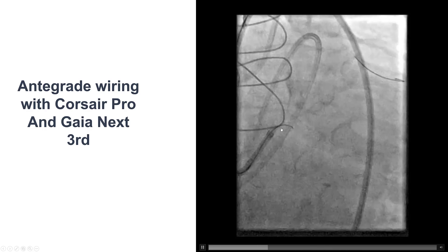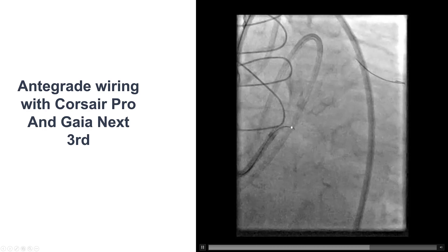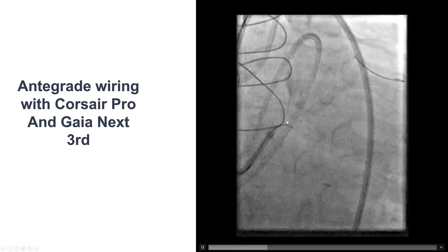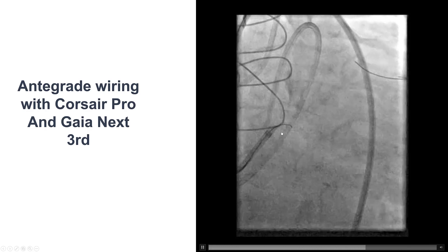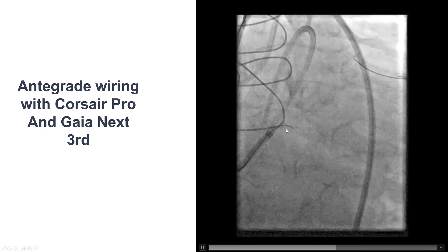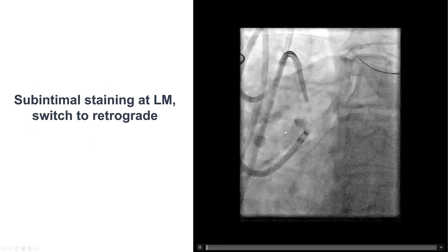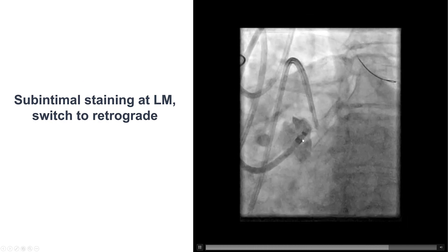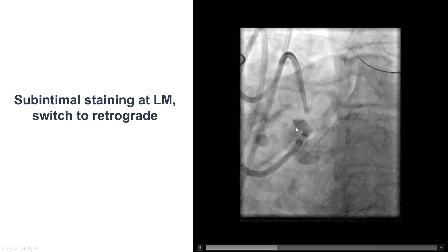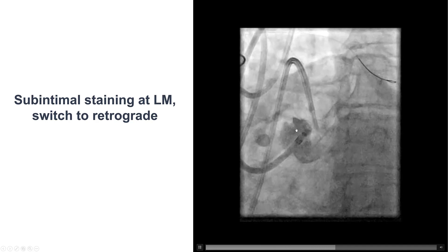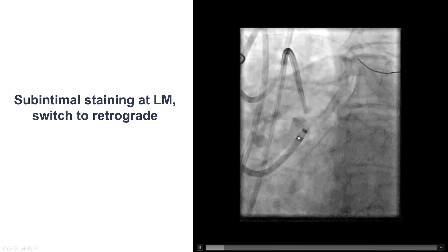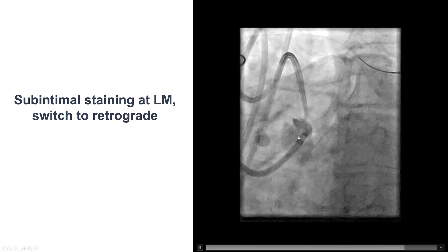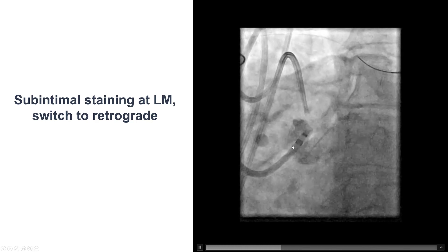We first tried to engage the left main, which was challenging. We finally thought we positioned it at the flush ostial occlusion, and then tried with the Gaia Next 3, but were unable to penetrate. Guide injection showed some subintimal staining, which made us not want to do any more manipulations on the aorta, given that the guide was in the aorta.